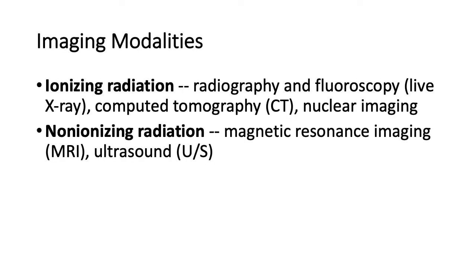A variety of imaging modalities exist. Broadly speaking, we can categorize them based on whether ionizing radiation is used or not. In this PowerPoint, we're going to focus on radiography, or x-rays.